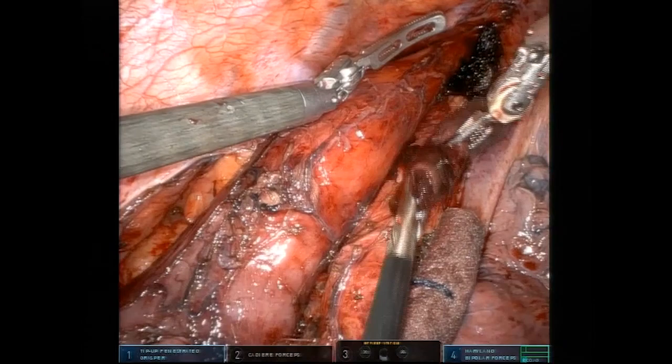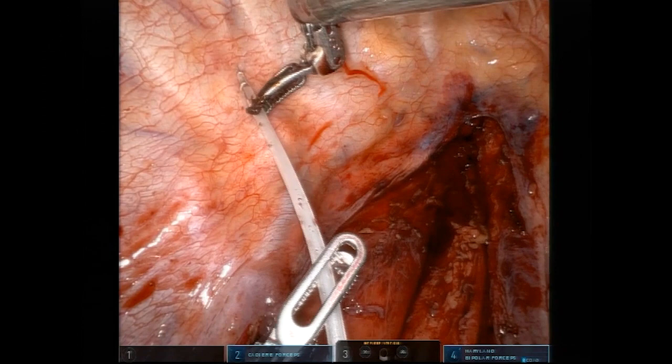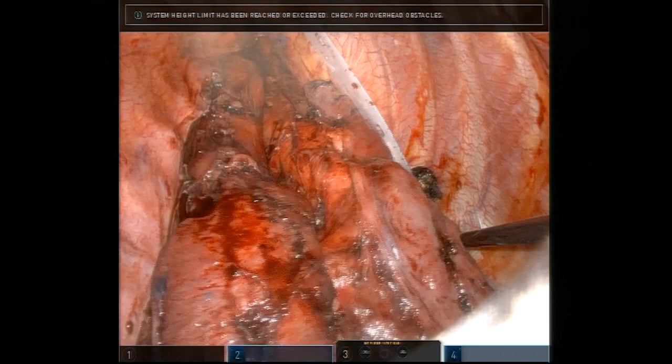We then inject the paravertebral intercostal spaces with a mixture of Exparel and Marcaine for postoperative analgesia. A chest tube is inserted and the lung is reinflated.